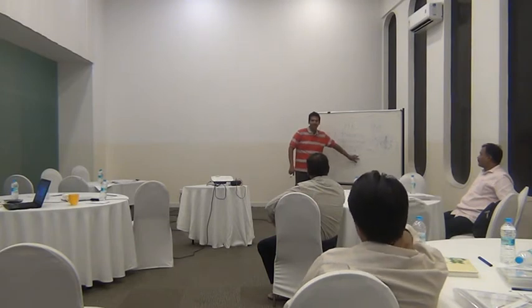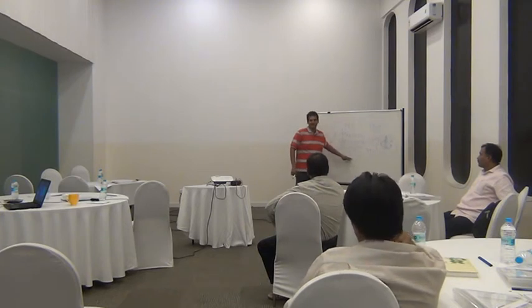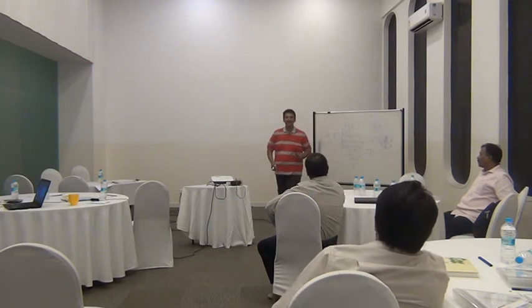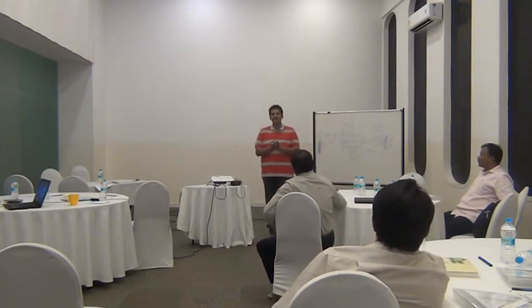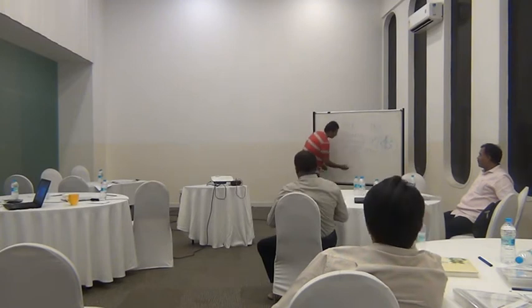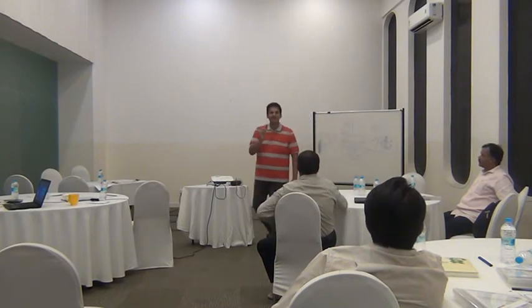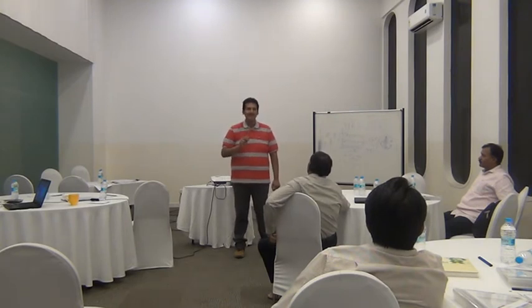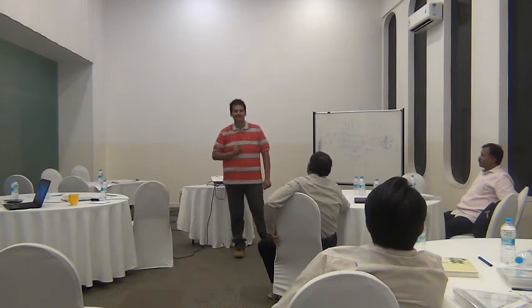And few protons which have high energy align anti-parallel to the field. Most protons align parallel, few align anti-parallel. The result of this is that you have more number of protons, and this rotation of the proton, you call it as precession. The rotation is called as precession. And this precession frequency again depends upon the strength of the magnetic field.